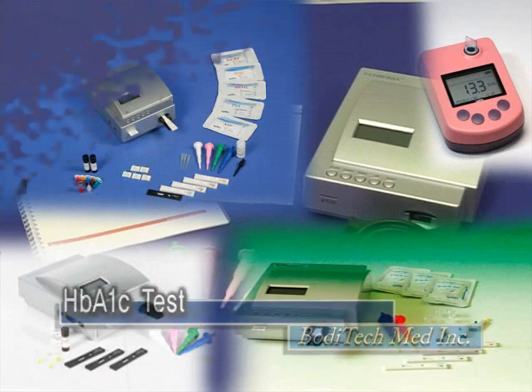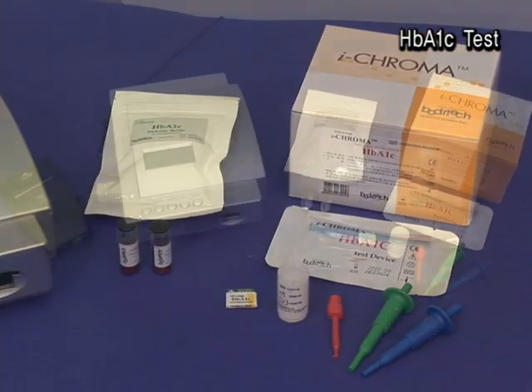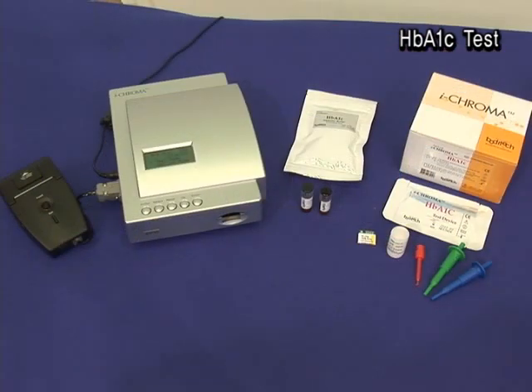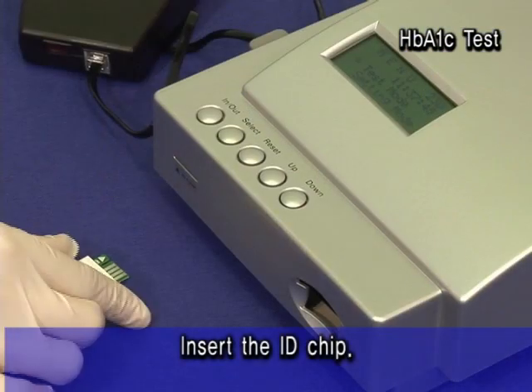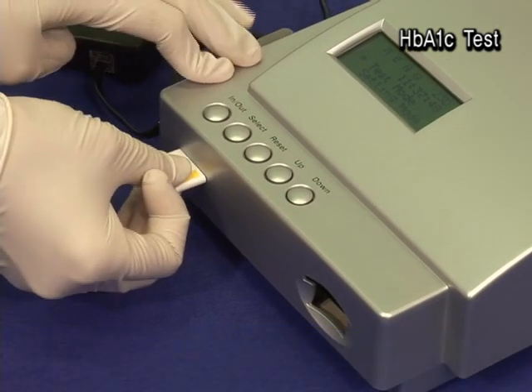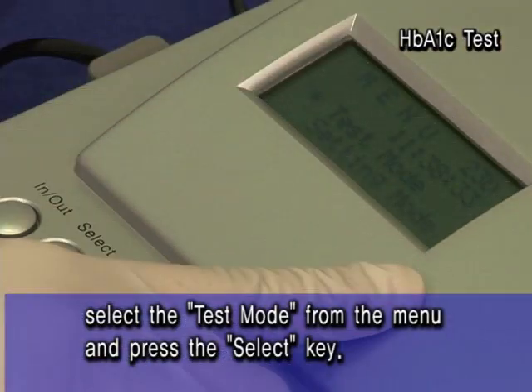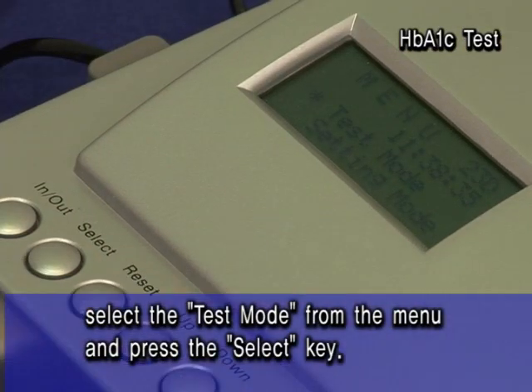HB-A1C Test. Insert the ID chip. Select the test mode from the menu and press the SELECT key.